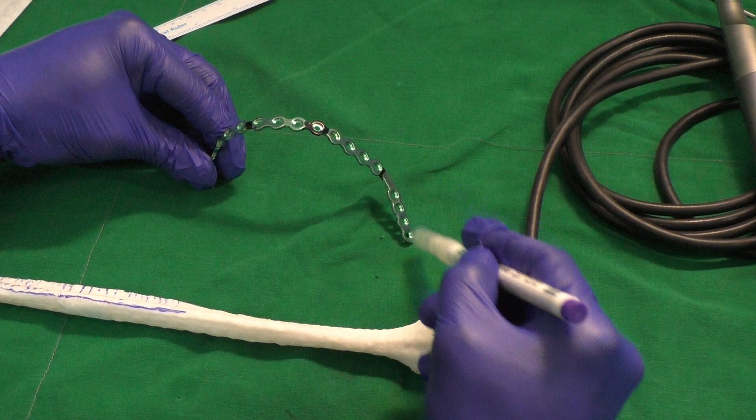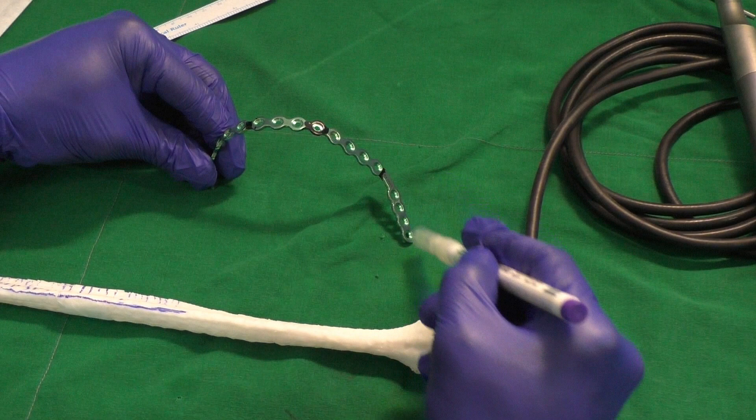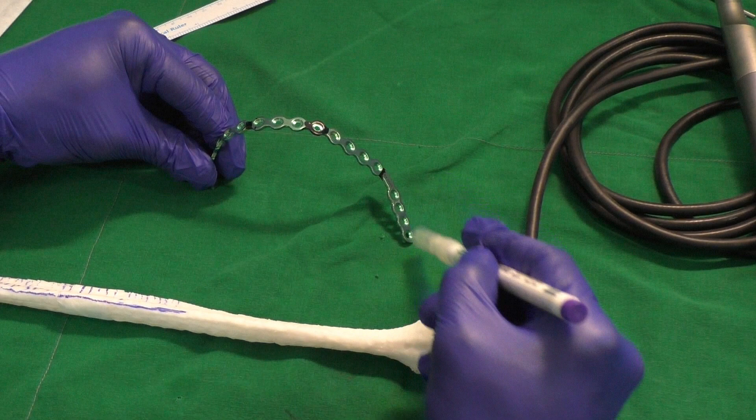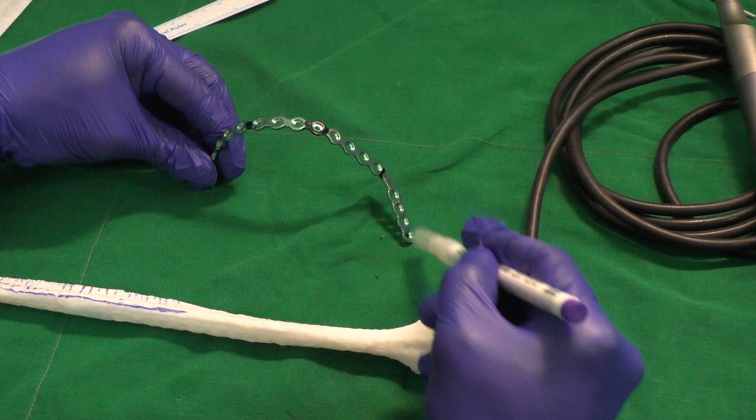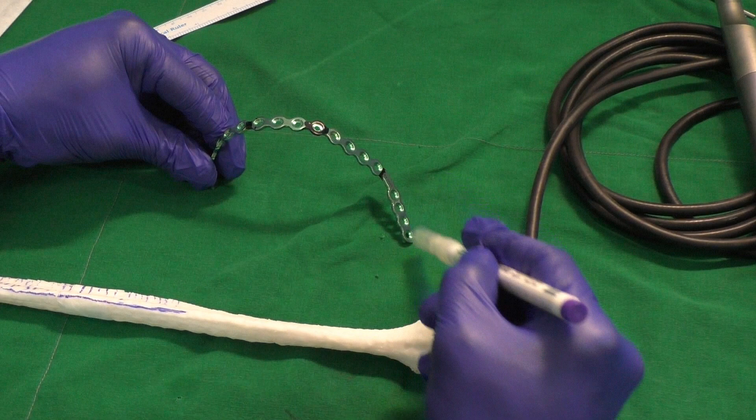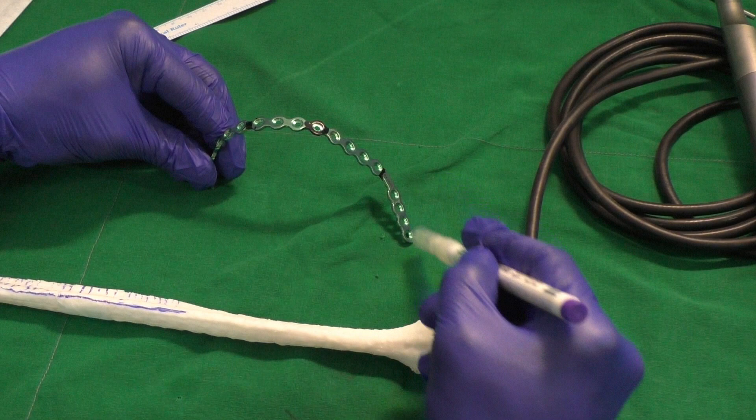The first blue mark on the left side indicates where the proximal segment of the fibula begins. The circular marking indicates where the osteotomy of the bone has to be made, and the blue mark on the right side near the ascending ramus is the end of the second osteotomized segment of the fibula. So we need one osteotomy in the region of the circle and two segments of fibular bone between the native mandible.